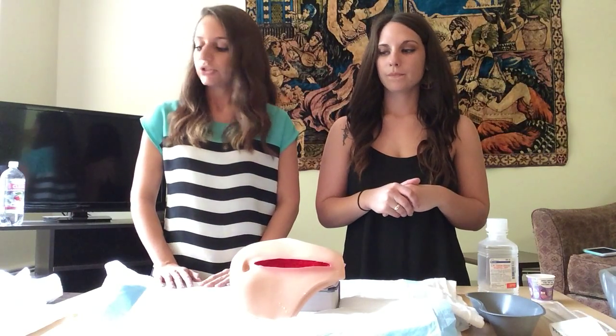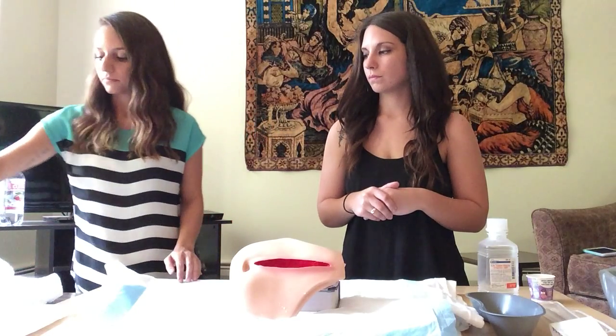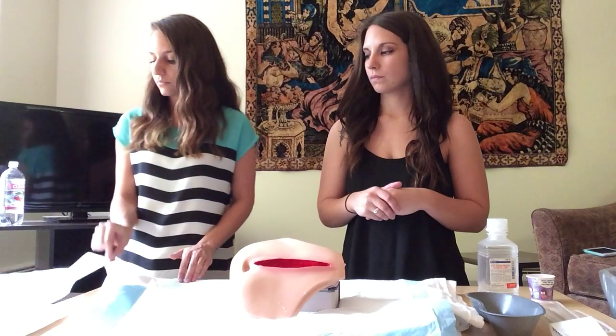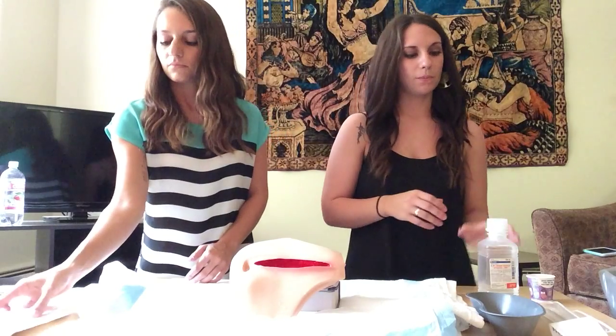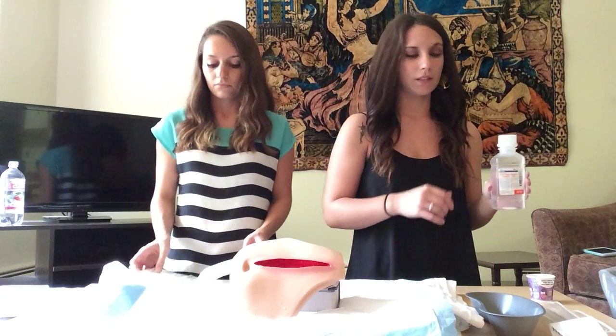The next step is to open our sterile field and get our sterile gloves on. At this time, I'm also going to pour the sterile irrigating solution into the sterile container.